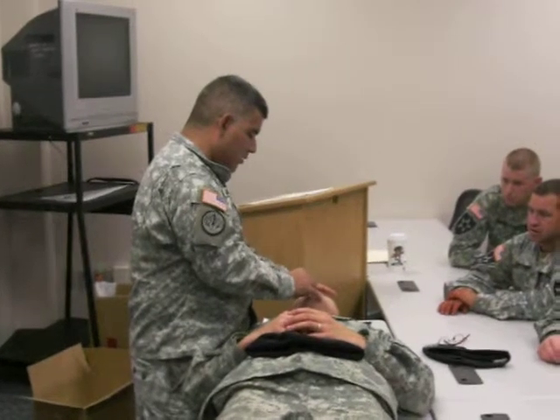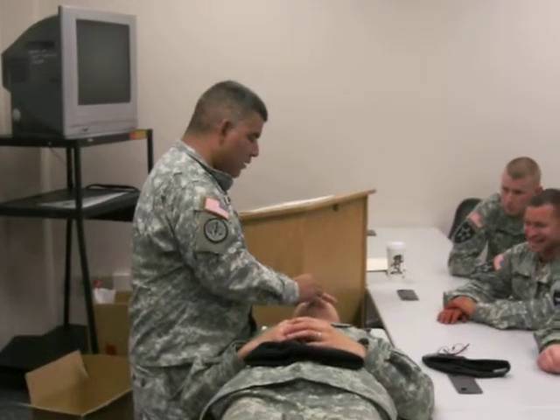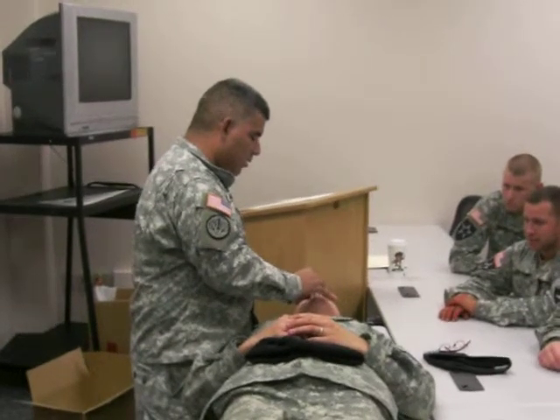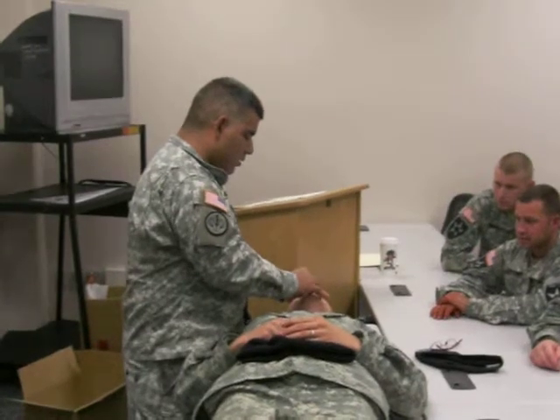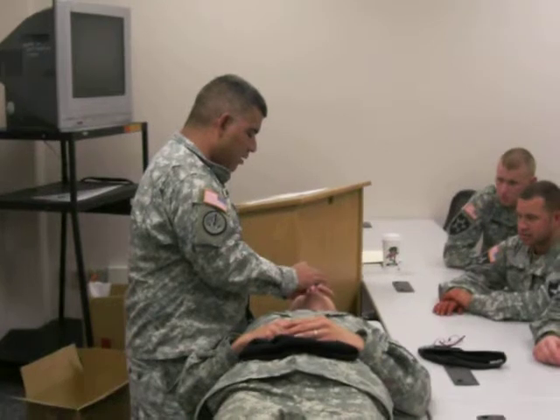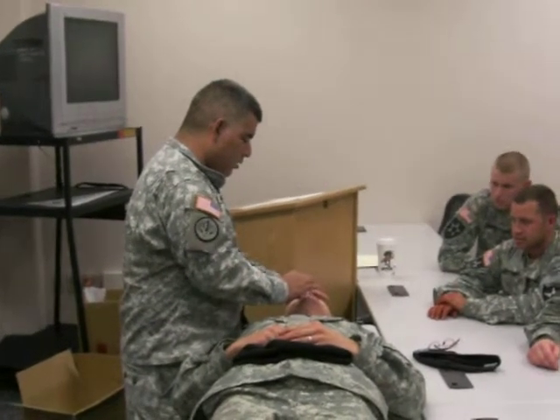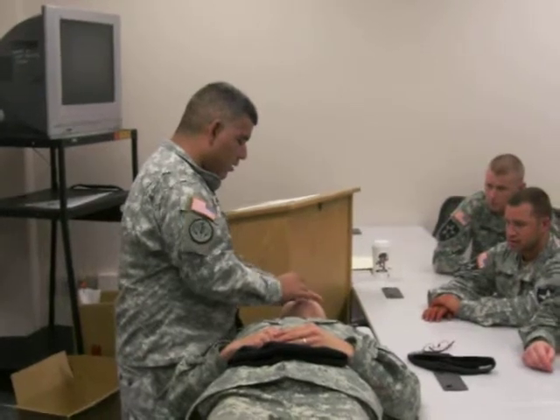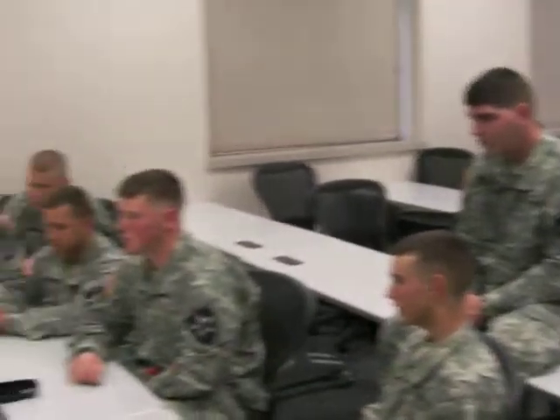push it in. It should go in and slide in, slide in, slide in. Breathe, swallow, swallow, swallow. Breathe, breathe, breathe. Breathe, breathe, swallow, swallow. Did it hurt? Okay.